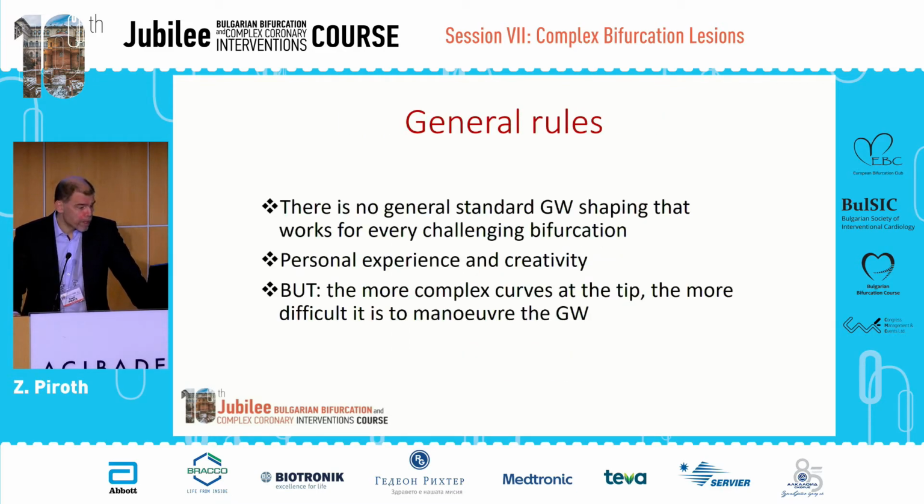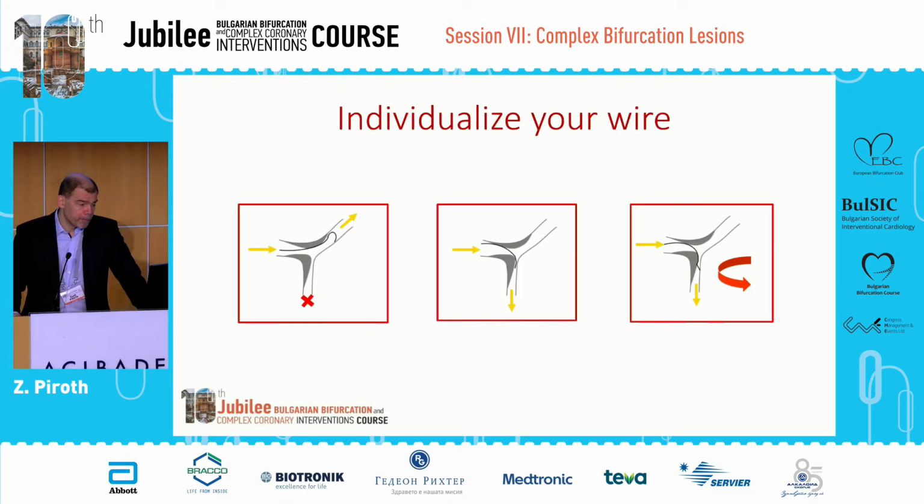As a general rule, there is no standard guide wire shaping that will work for every single bifurcation. So we should use your personal experience and creativity, but again, caution should be exerted with applying too much creativity, because the more complex the tip, the curve of the tip, the more difficult it is going to be to maneuver once you are in the side branch.